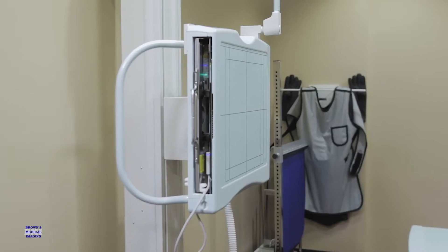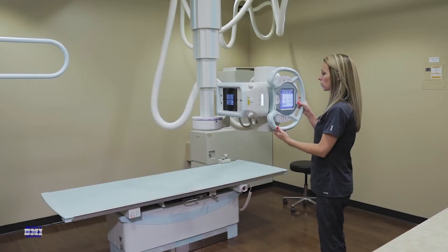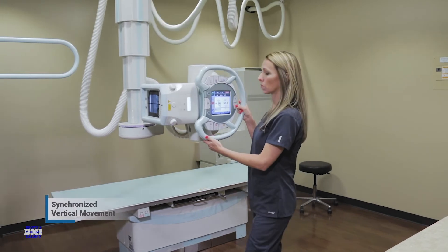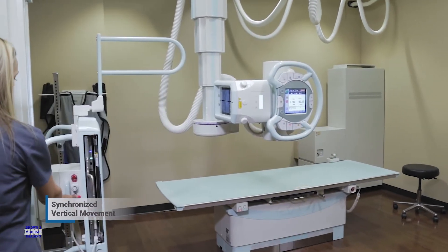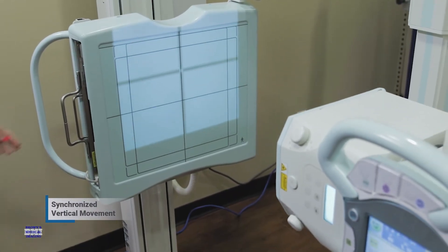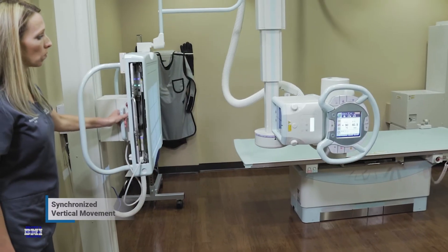Shimatsu also reduces patient dose with its removable grids located in the table and wall buckies. System operation becomes even easier with the synchronized vertical movement of the overhead x-ray tube and the wall bucky. With the touch of one button, technologists can synchronize the auto-tracking feature, allowing the technologist to stand close to the patient, ensuring patient safety.